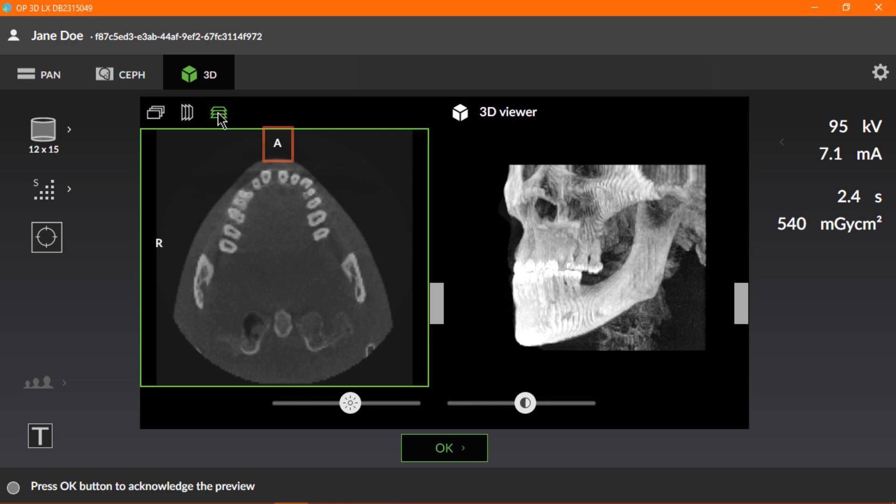The last icon is used to display the axial view. Again, here we'll see A, which indicates the anterior view, and R, which indicates the right view. You can scroll through any of the previews using the slider on the right side of the image.